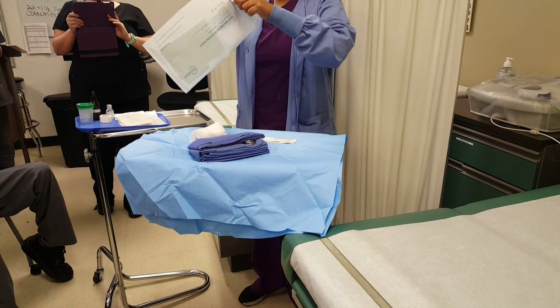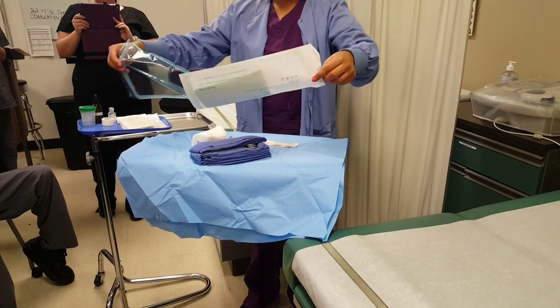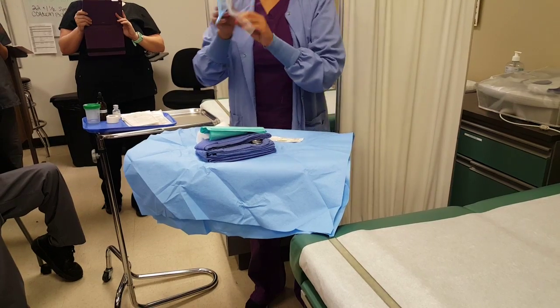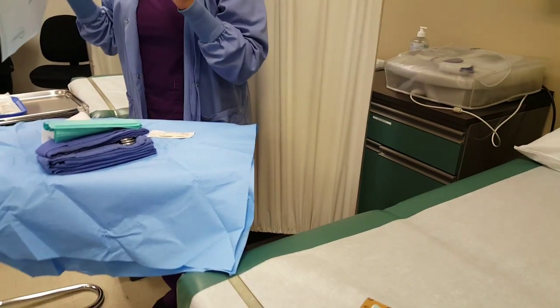Miss Newman and I will be watching how you drop your items. If we tell you there's a problem, you have to start all over again. Remember how crucial it is — these items are going to go into your patient's body. You're going to be touching an open cavity, so eliminating the risk of infection is what we're trying to achieve.